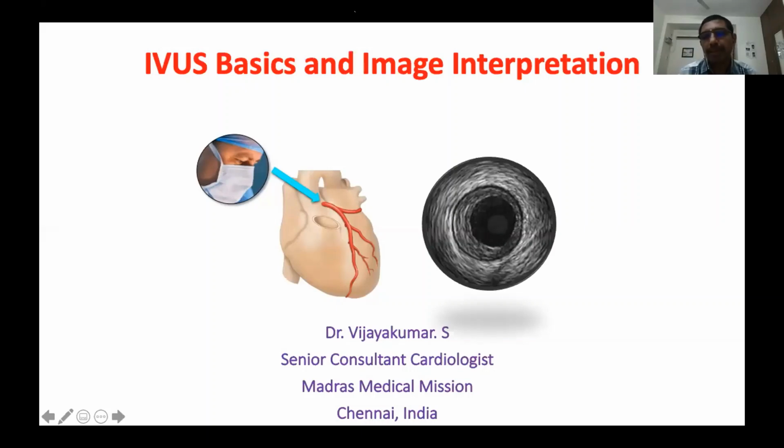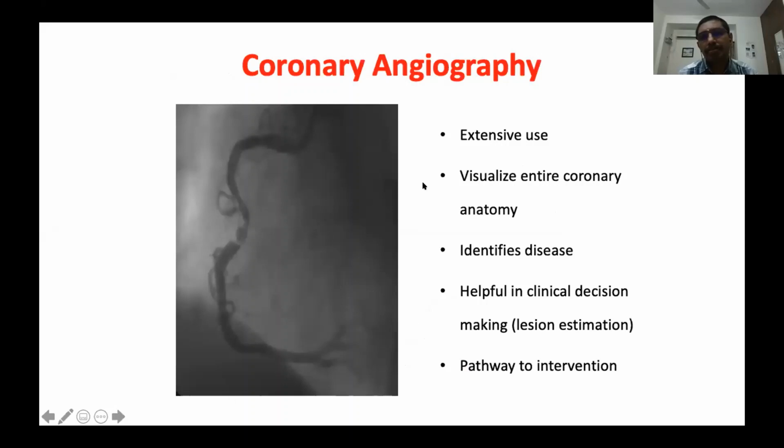I thought maybe it can be a big topic by itself. So just to stop with image interpretation, maybe if you have time, in the next webinar we can discuss how to use IVUS imaging for simple and complex lesions. So to start, some basics.